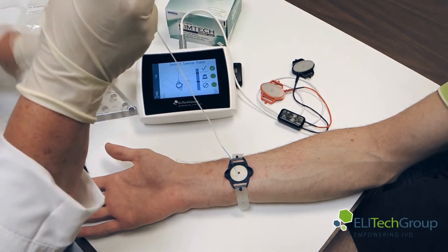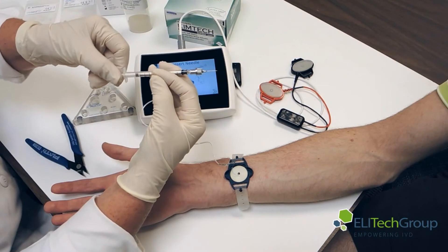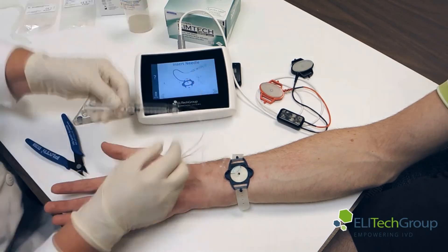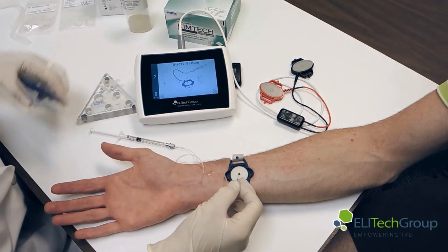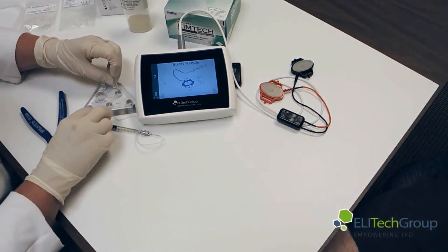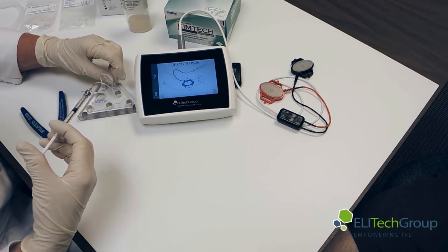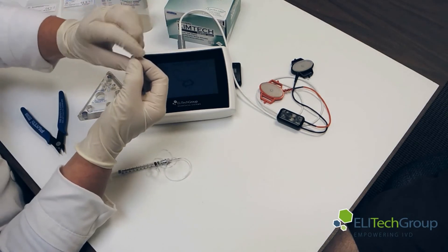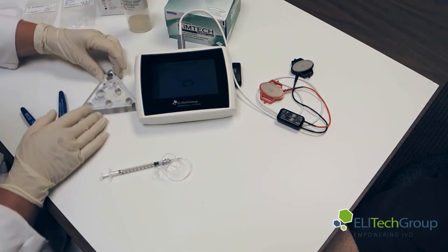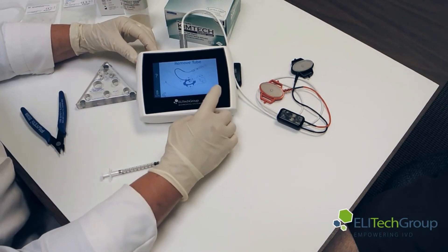We can keep it and mark that the sweat test is valid. Now we have the syringe — make sure the syringe is open like this. We add the micro-bore tubing to it. Collect the sweat by nipping. Now move to our collection device. We have enough area in the syringe to push the sweat into our collection tube. You can see we have it in the bottom of the tube. Close the collection tube. You can see you have enough collected to do your sweat analysis. We've inserted the needle, pulled the syringe out, and collected the sample.